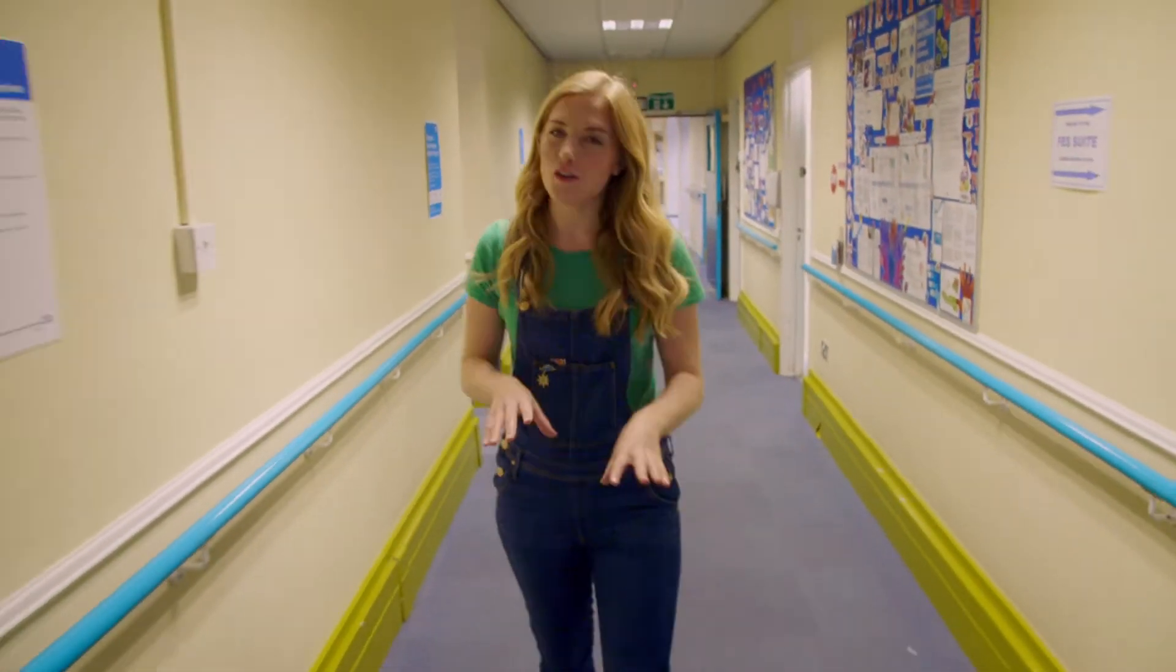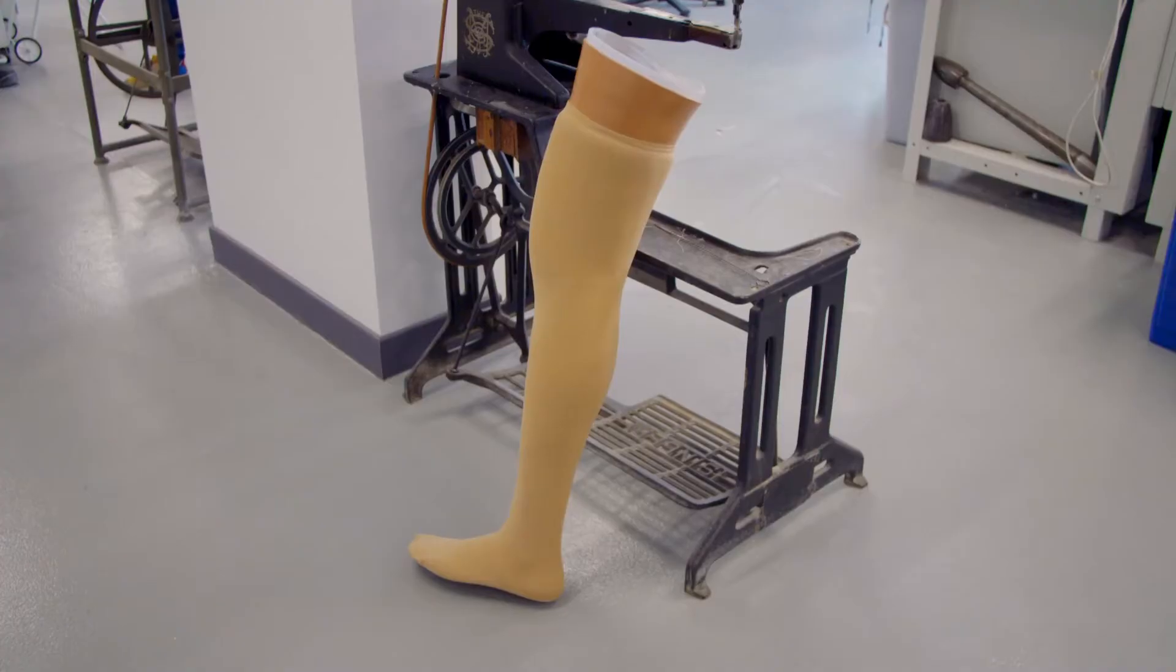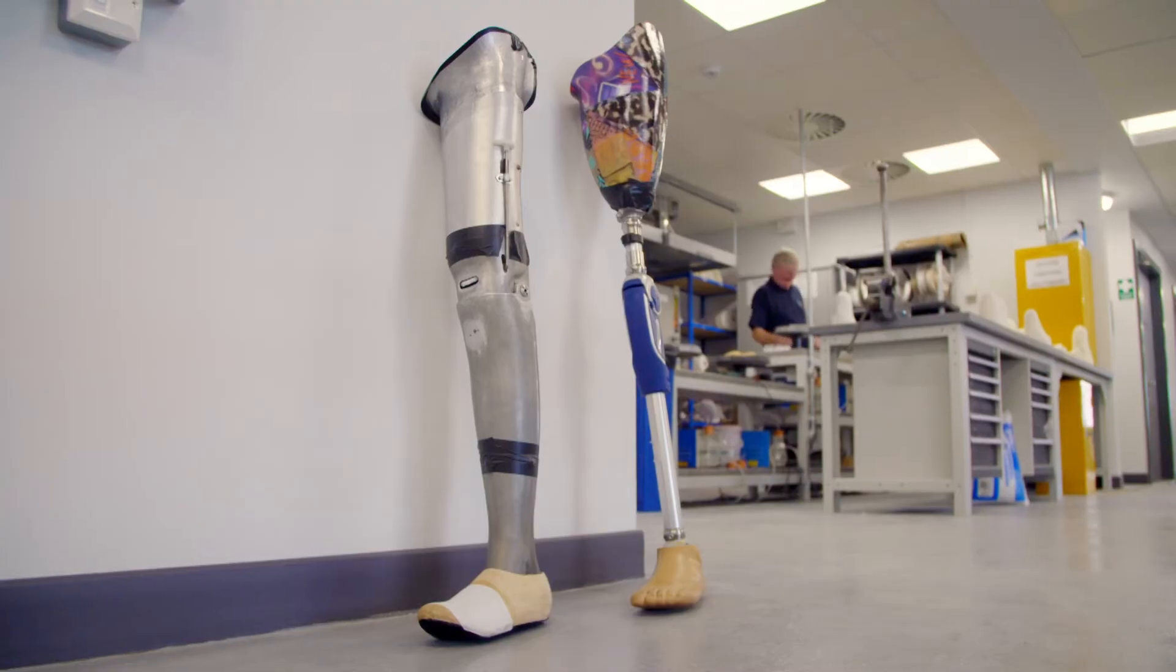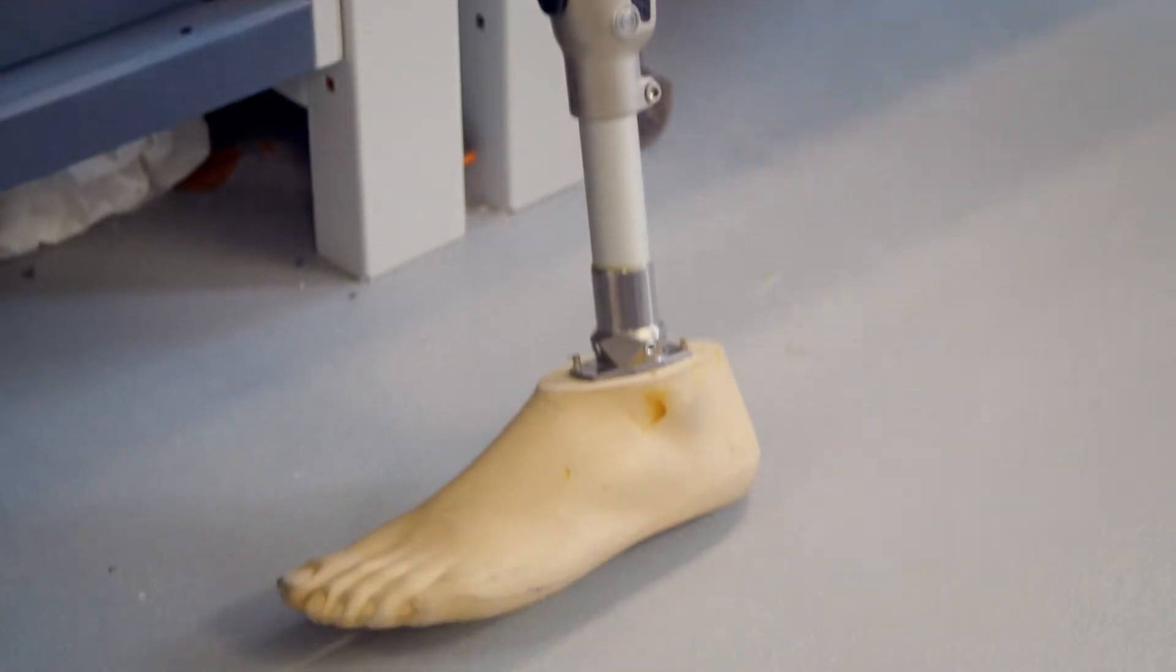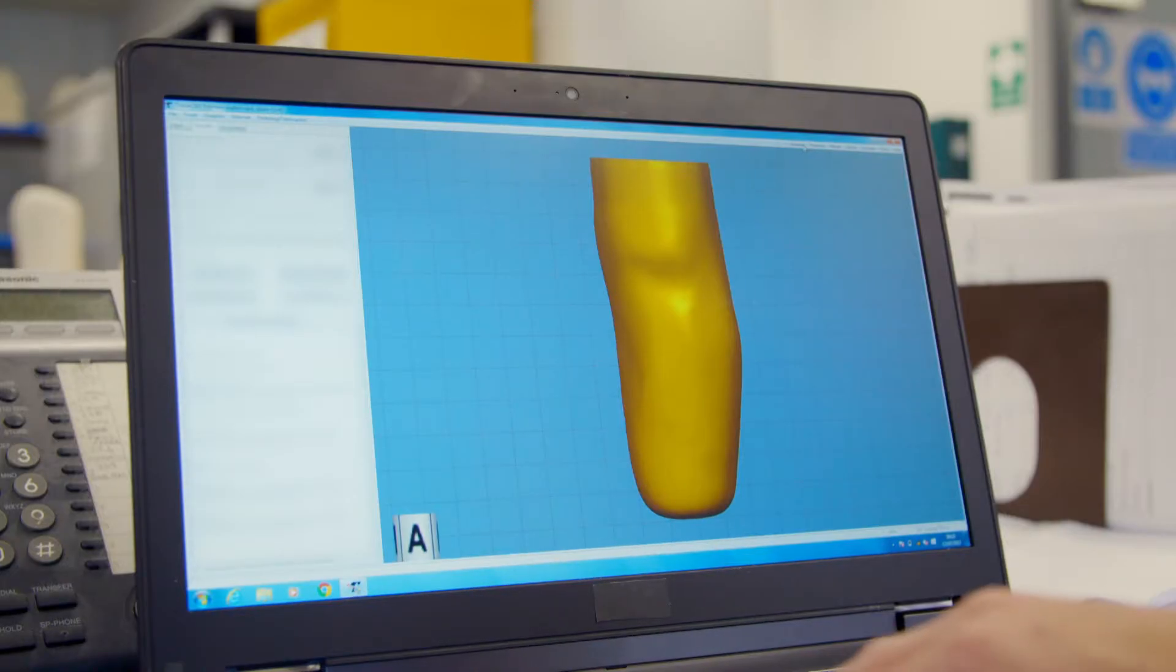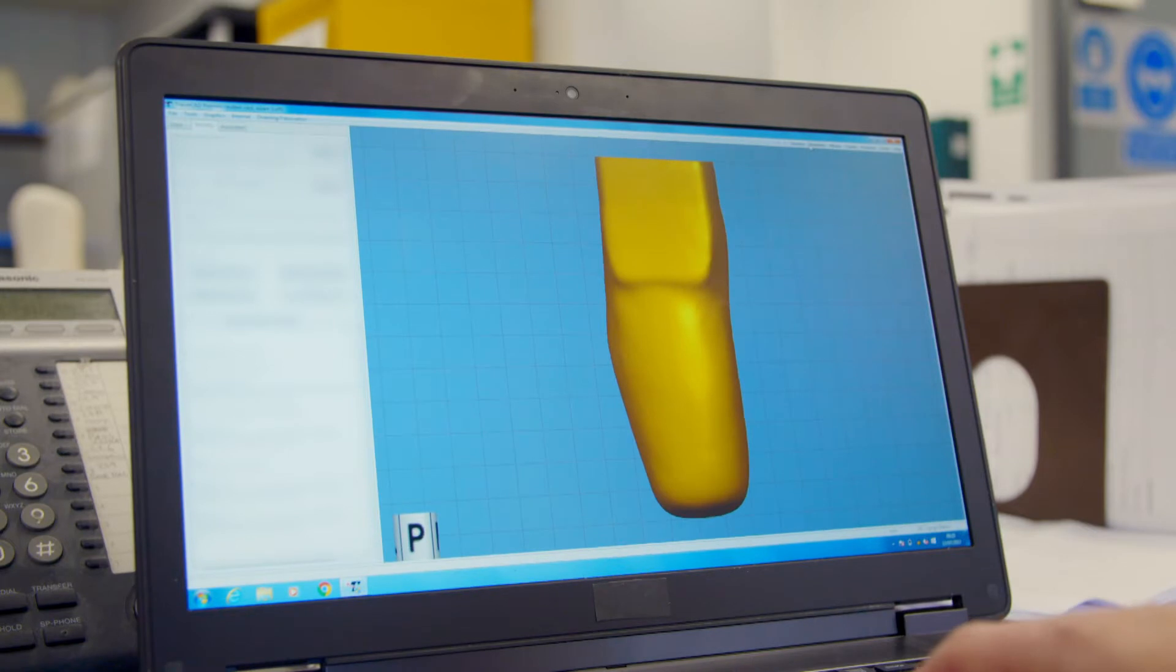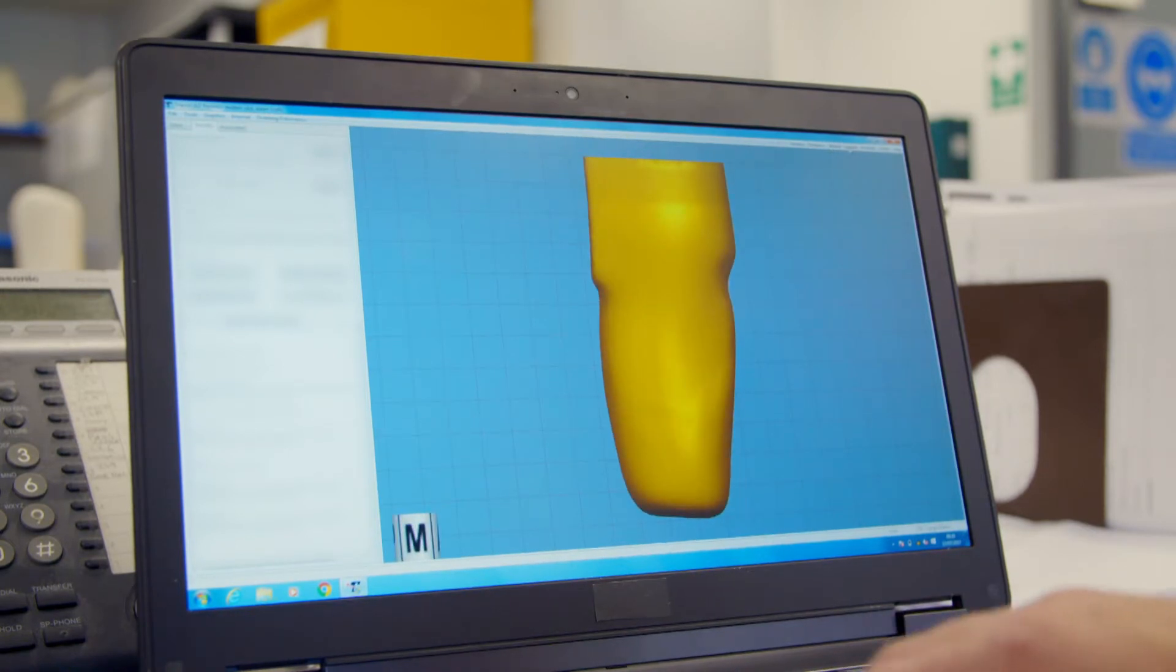Today I've come to a special hospital where they make different types of prosthetic legs for lots of different people. They start with a three-dimensional or 3D picture of a person's leg that the new prosthetic leg has to fit.